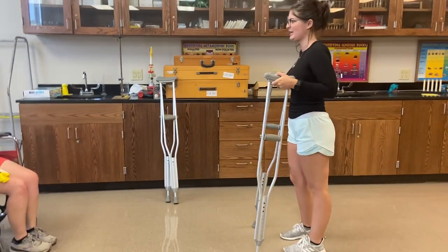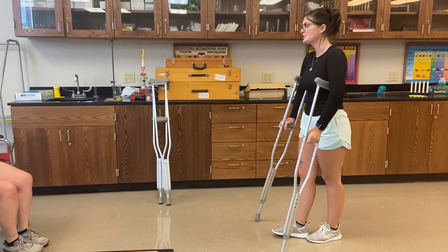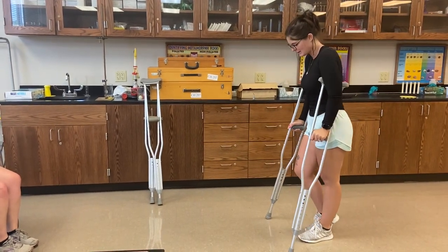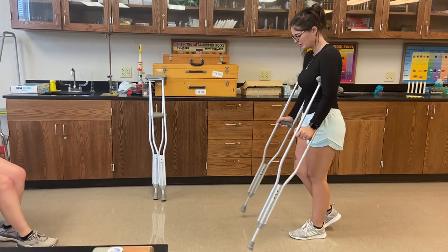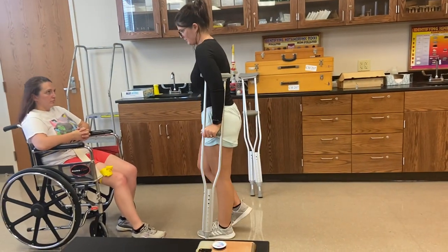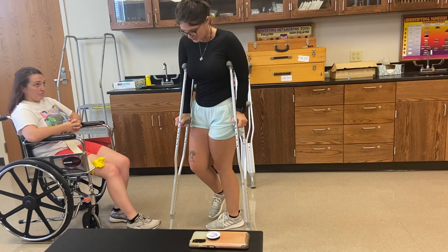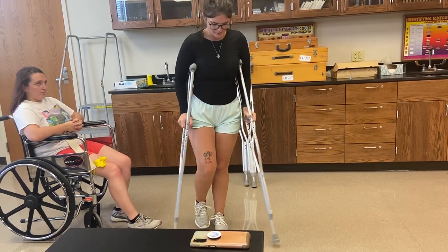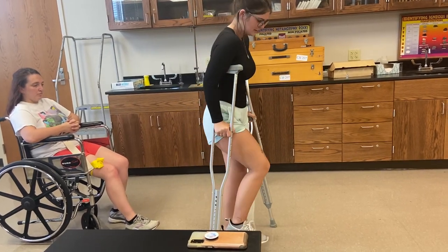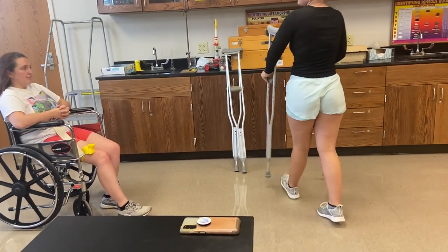The last gait pattern we're going to do today is a three-point swing-through. This is for you since you are non-weight bearing. You're going to do crutches, push yourself off with that left foot, crutches, push yourself off. Then you're going to pivot — move that left foot, pivot, left foot. Sound good? Sound good.